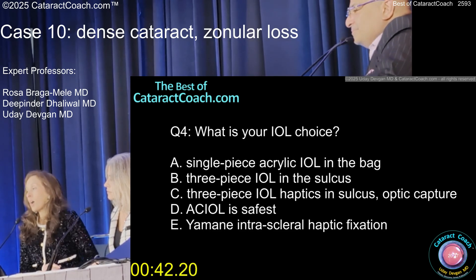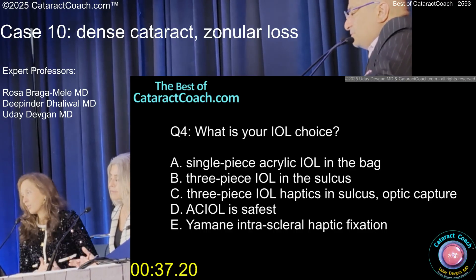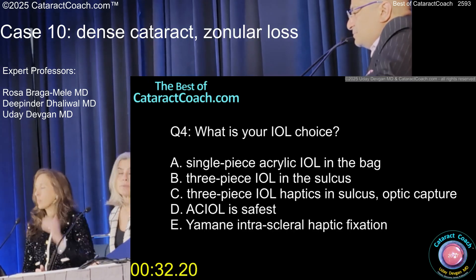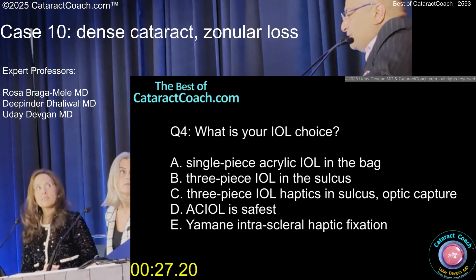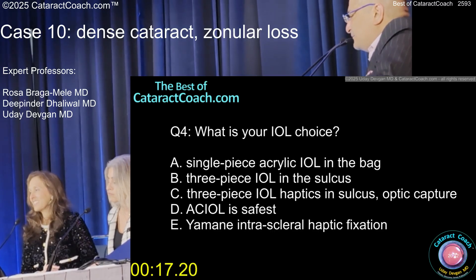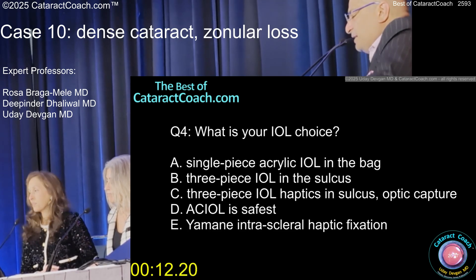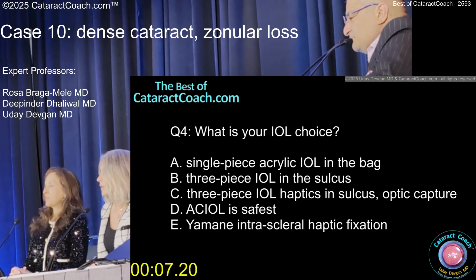It's very safe to do a three-piece IOL with haptics in the sulcus and optic capture because the rhexis is nice. If everything is stable, nothing wrong with putting a single-piece in the bag. With that focal zonular loss now addressed by the CTR, you have pretty wide-open options. You're not doing a presbyopic lens, are you? No — it's hard to keep it centered sometimes. For IOL choice I would do a toric, but not presbyopic.